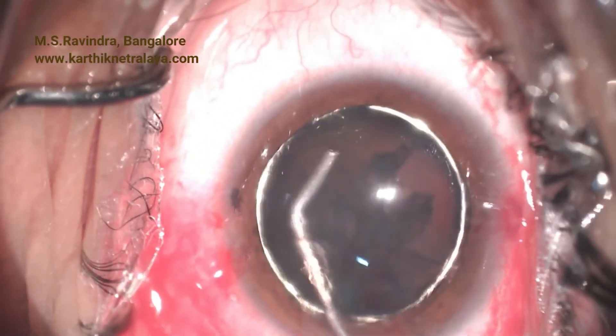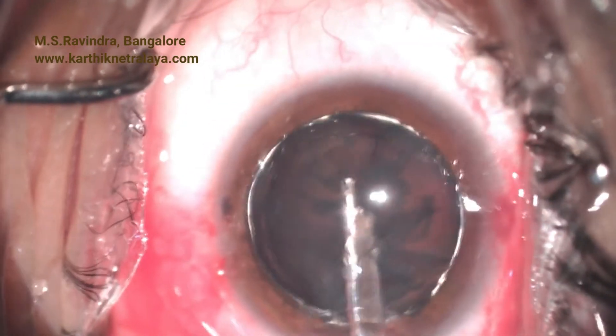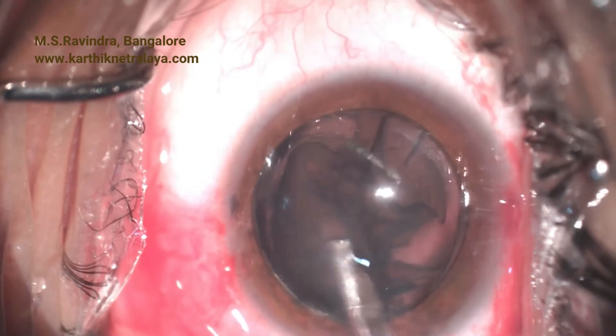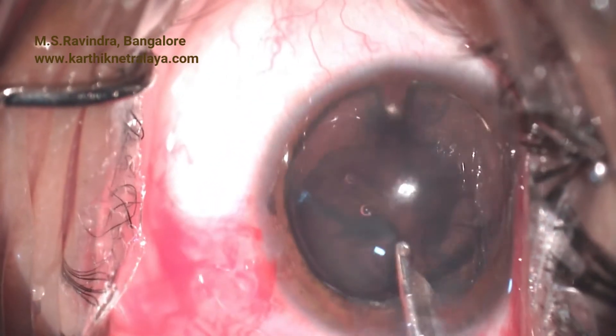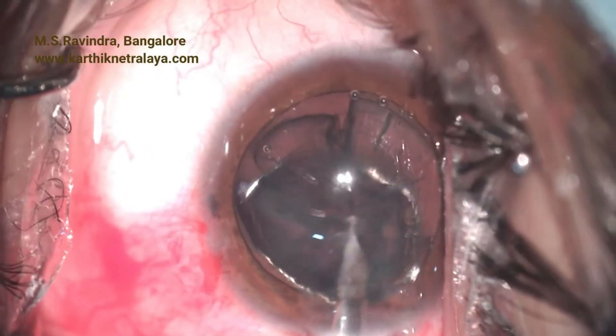The soft lens undergoes hydrodissection, hydrodelineation, and delamination segmentally. The entire lens, being soft, can be aspirated with a Simcoe irrigation-aspiration cannula. The posterior capsule is maintained in this case along with the zonular apparatus to retain the anterior hyaloid face.